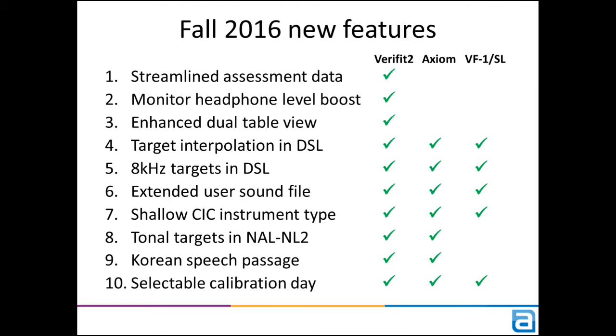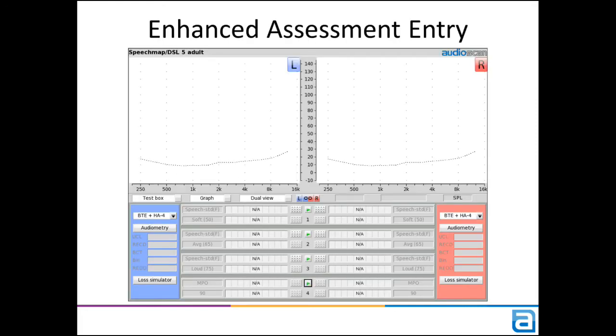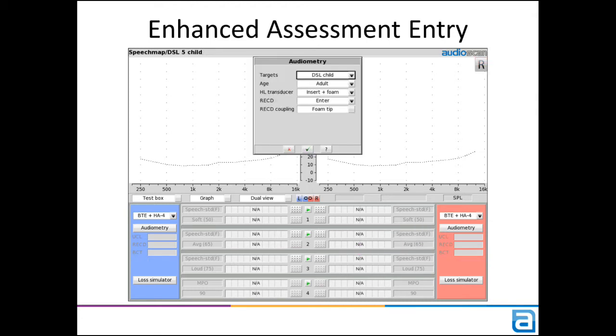The enhanced assessment entry screen is a significant benefit to Verifit 2 users who enter audiometry data manually. When you're in SpeechMap and wish to enter assessment data, you still click on the audiometry button. The window that comes up next will look a little different. In here, we still select our target rationale, age where applicable, HL transducer, and whether the RECD will be average, entered, or measured.